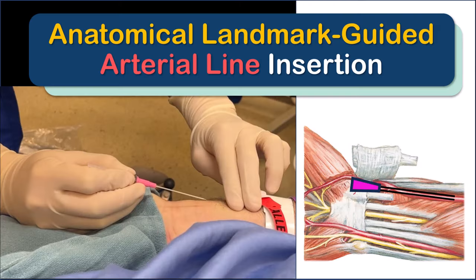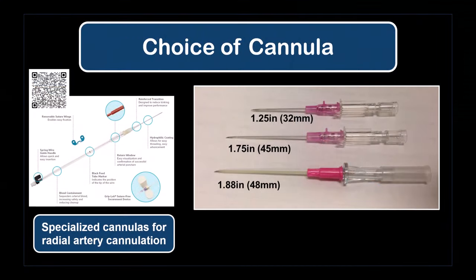This video outlines the principles of landmark guided arterial line insertion. There are specific arterial line cannula sets available, but a 20 gauge intravenous cannula is very commonly used and will be illustrated here.